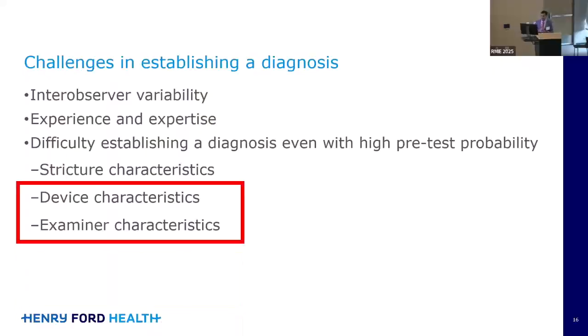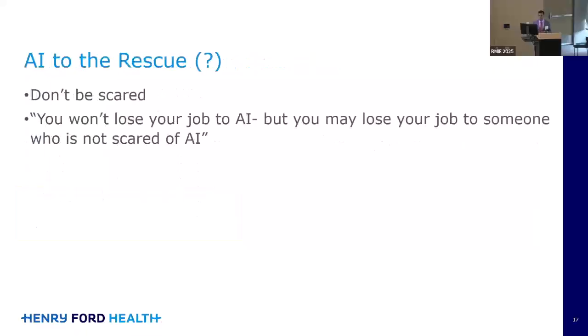The things that I think we can change, we can't change that cholangiocarcinoma is desmoplastic, that it's often paucicellular, that the malignant cells exist in skip areas, often outside of the bile duct. But perhaps we can improve devices that will help us get there? And could we use something that helps us be better as examiners to really get to a better, earlier diagnosis?